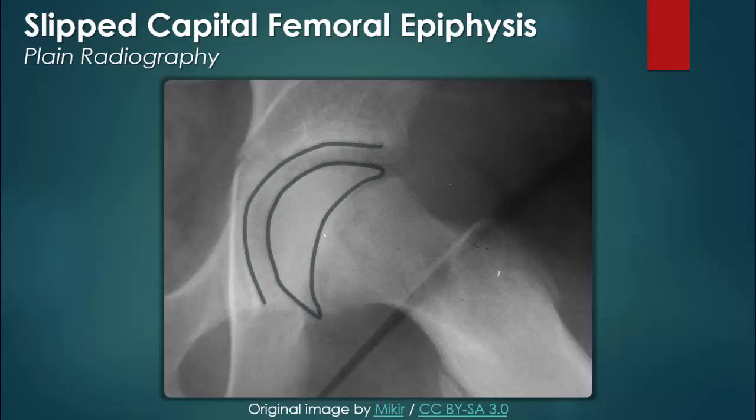Slipped capital femoral epiphysis is actually a misnomer. As seen in this image, the femoral epiphysis is located in the normal position within the acetabulum. The pathology, in fact, usually involves slippage of the femoral head at the metaphysis. Focusing on the proximal femur distal to the growth plate, we can see that the femoral neck is displaced superiorly, which in turn makes the epiphysis look like it has slipped inferiorly.